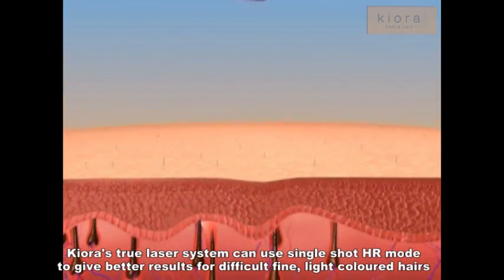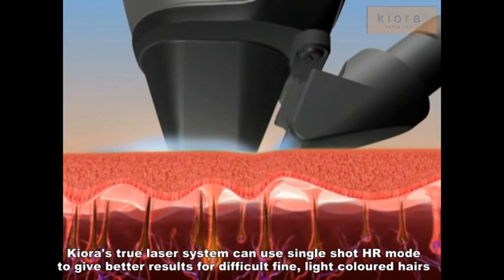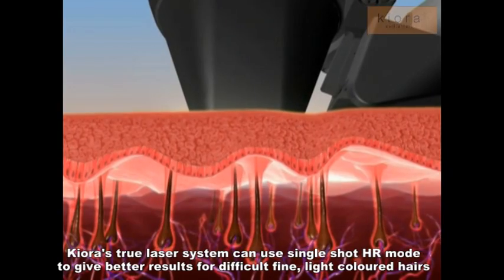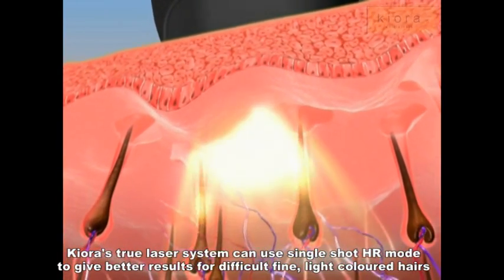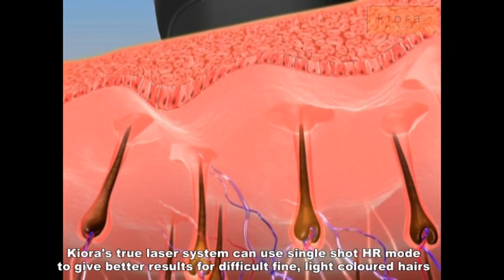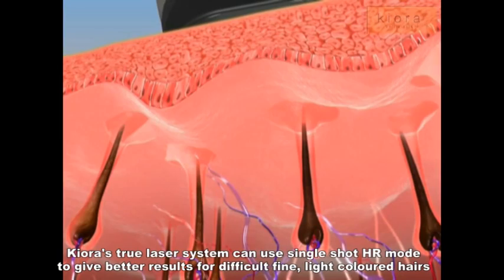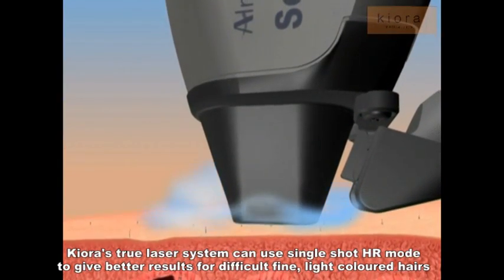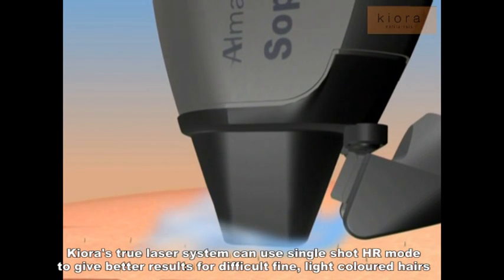The Soprano XL's HR mode utilizes a single-pulse, high-fluence approach to deliver heat energy selectively to the hair follicle, without affecting the surrounding dermal tissue. The energy absorbed by the melanin in the hair causes heat injury to the hair, preventing its further growth. Simultaneously, intense contact cooling is applied to the epidermis to prevent superficial heat injury and to improve patient comfort.